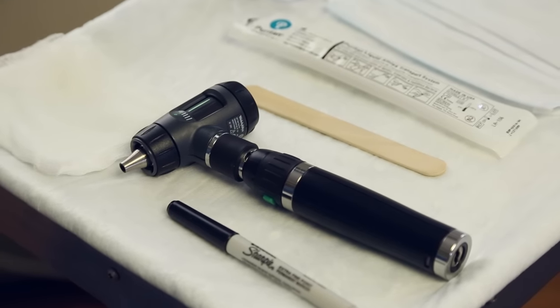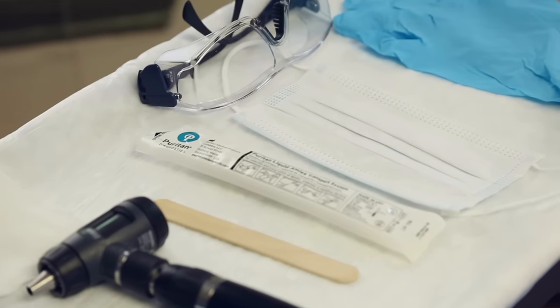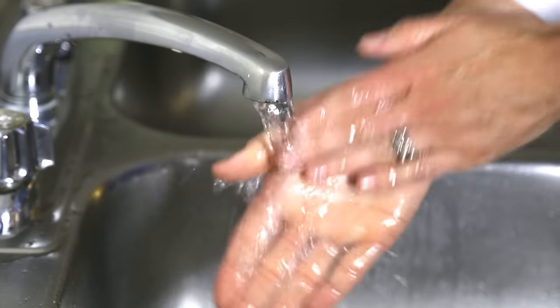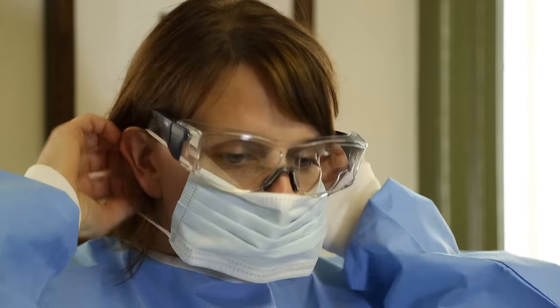It is recommended to wear appropriate personal protective equipment when collecting samples. Wash hands. Put on gloves and surgical mask.